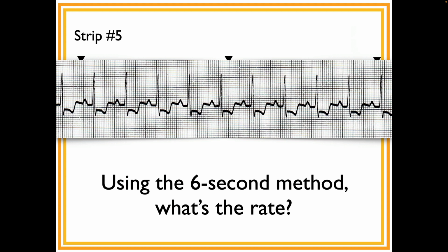Okay, so Chris, what'd you get? 100. Okay, so I'm going to start at this end just because this one is so close to the mark there. So I've got 1, 2, 3, 4, 5, 6, 7, 8, 9. But the mark is here. So actually, it's a little bit under 100. Can you see that? So I would have it more like maybe 95.